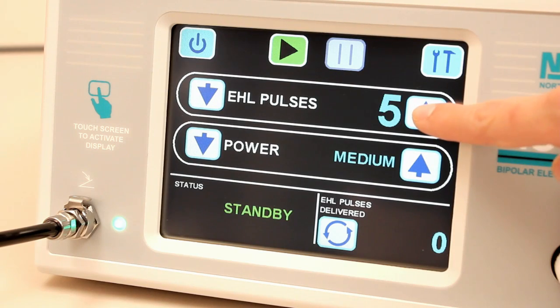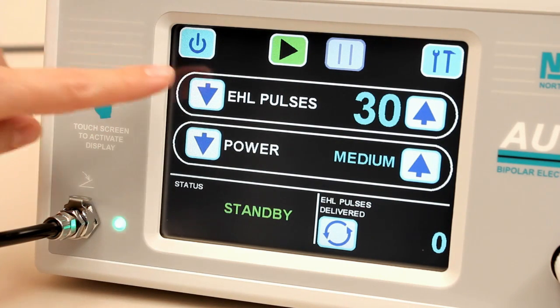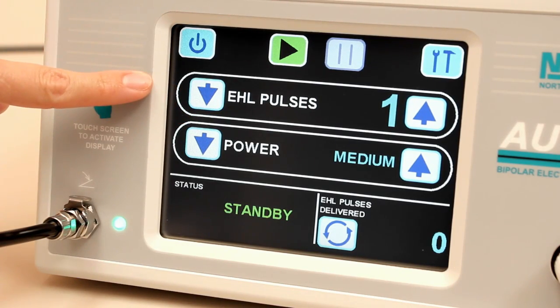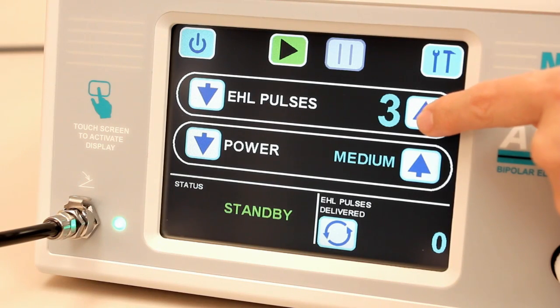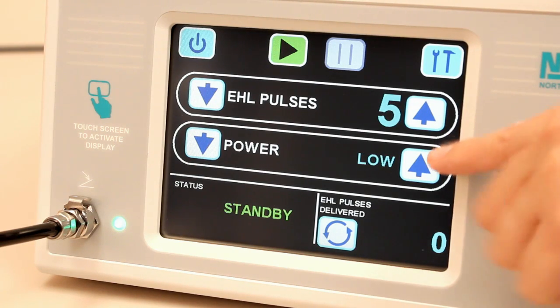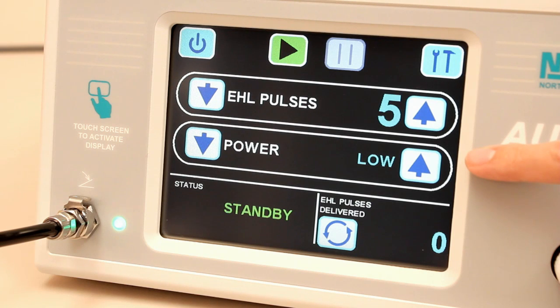With the Autolith Touch system, the physician can gradually increase the number of pulses delivered per foot pedal depression as well as the power level of the pulses to effectively break the stone into smaller pieces for complete removal. When used for the first time, it is recommended to start with one pulse per foot pedal depression, but the value can be adjusted from 1 to 30 pulses. A setting of 5 pulses per foot pedal depression provides thorough stone destruction while allowing for control of the probe tip and its proper alignment to the stone surface. The power level can be set to low, medium, or high. It is recommended to start by using low power, as this setting can be quite effective and will extend the overall life of the disposable probe.